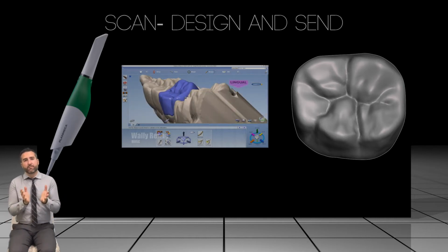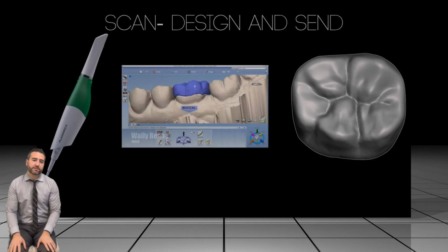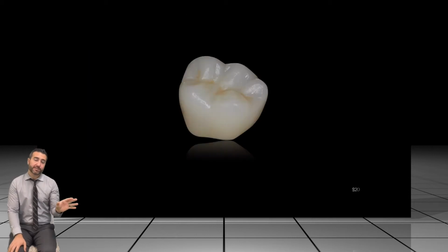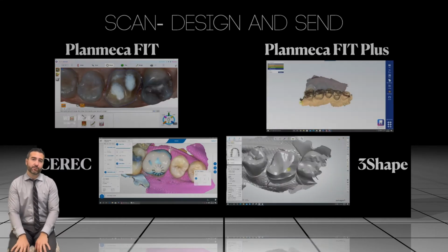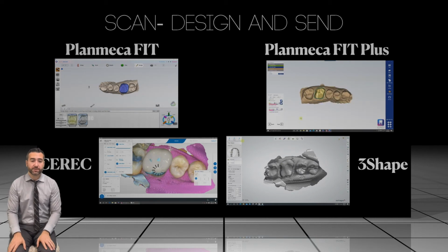Okay, so you got a scanner and maybe you're wanting to move up to the next level. What is the next level? Scan, design, and send. So now instead of scanning and sending to the laboratory, you're designing and sending your design to the laboratory, not your impression, but just your design. And you're going to get a crown back from the laboratory for anywhere from $15 to $30, depending on what milling service you partner with.